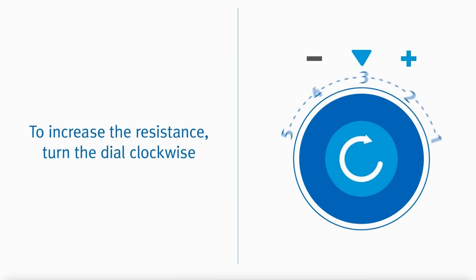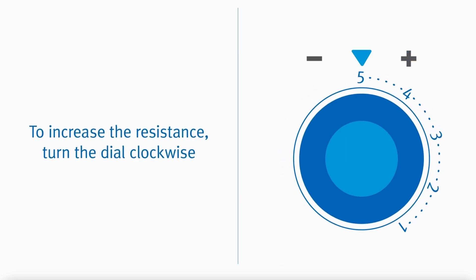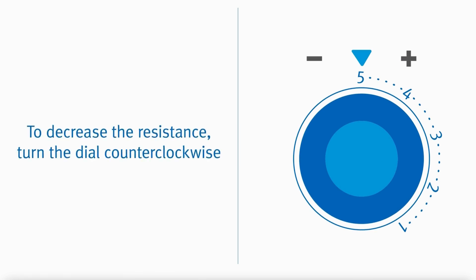To increase the resistance, turn the dial clockwise, with five being the hardest setting. Turning the dial counterclockwise will decrease the resistance, with one being the easiest.